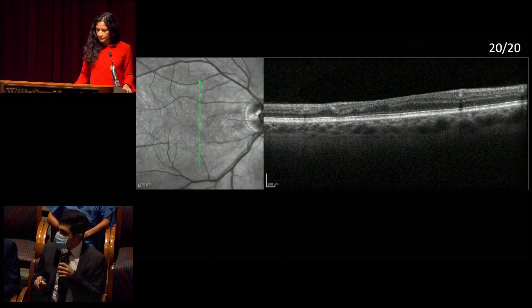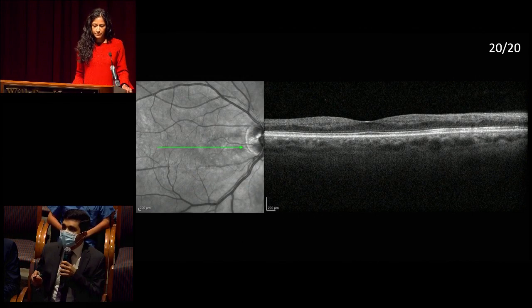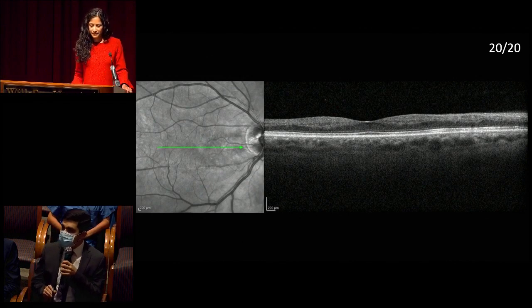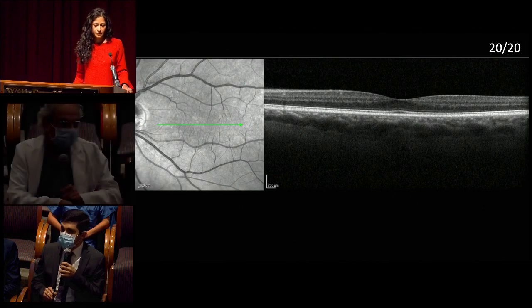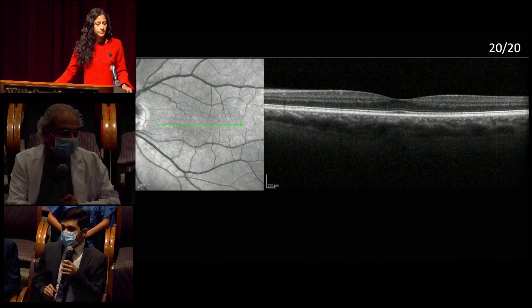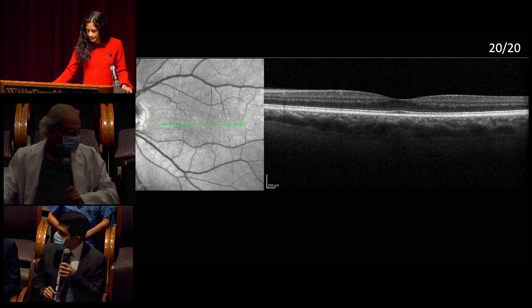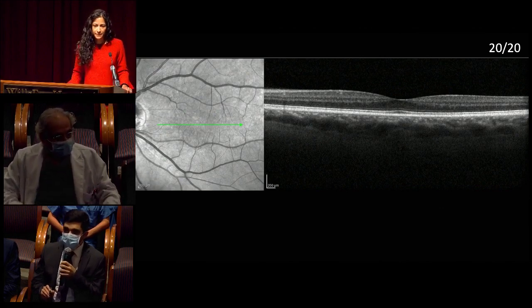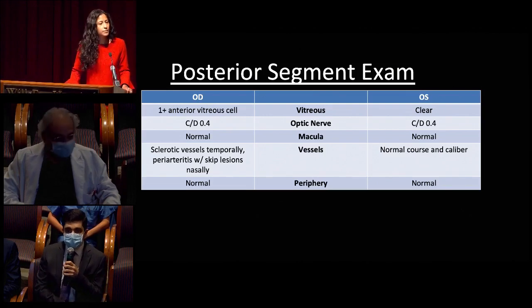Going back to the horizontal cut, you can see the nerve fiber layer is present nasally and then thins out substantially. Comparing to the left eye, it is slightly better defined. So the nerve fiber layer is being affected as well. The posterior segment exam was also notable for trace-to-1-plus anterior vitreous cell.